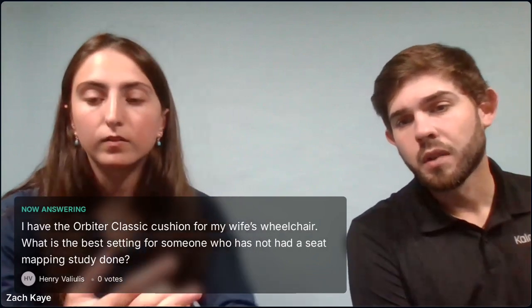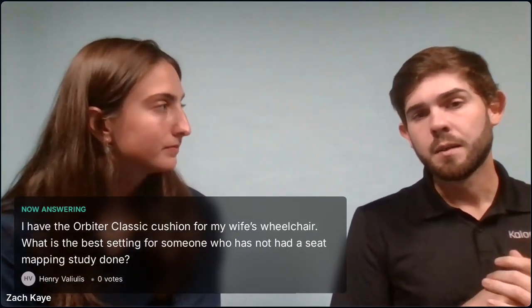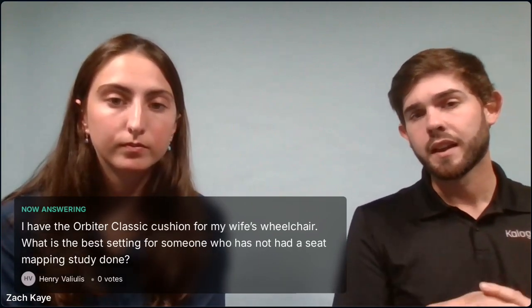The regular height of our air bladders: good question. The bladders vary based on size. Based on the actual pressure you have selected inside those air bladders, they will vary in height. If you had 20%, let's say, it's going to be a lot lower than if you have 100%, where you're going to get probably closer to that 4 inches you were talking about. I can't give you an exact number just because they do vary. And when there's no air in them, they're completely flat.